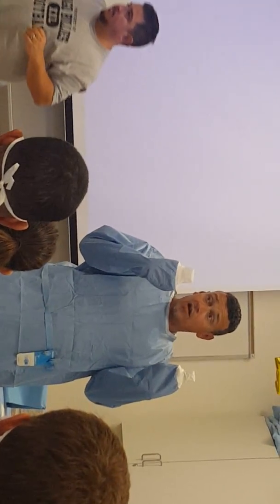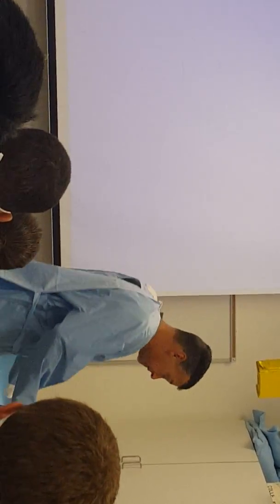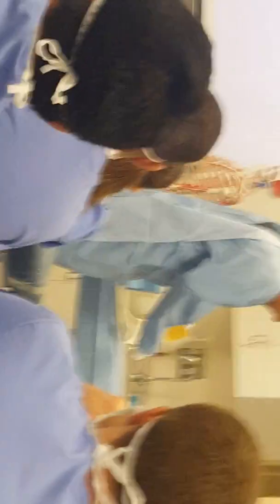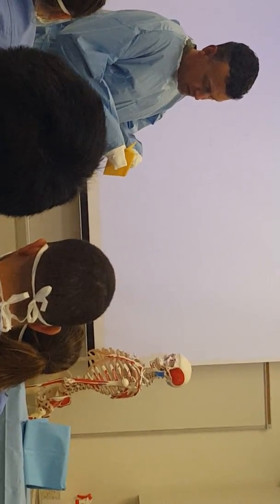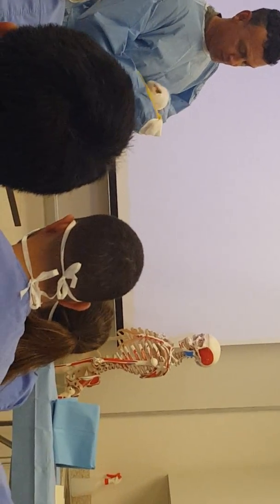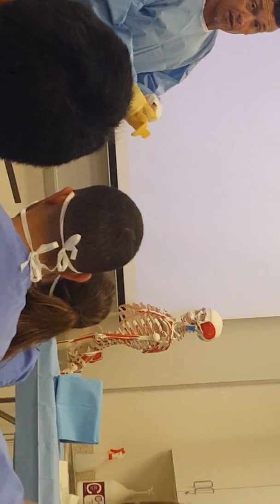Again, I have not taken my fingers through. I start with my right glove. Open it up. What did it say in the video? Thumb down, finger towards you, right? I grab the cuff and flip it over. See how that worked?